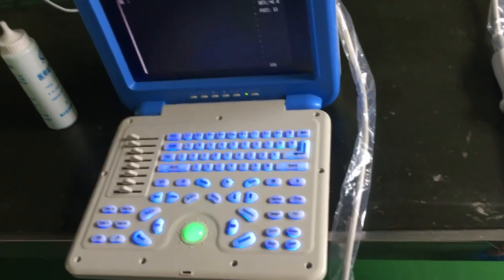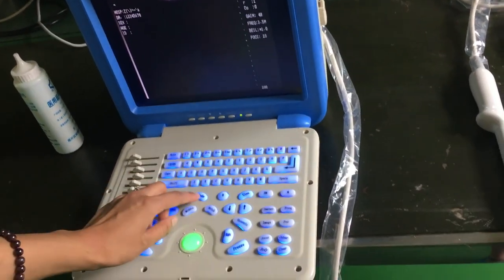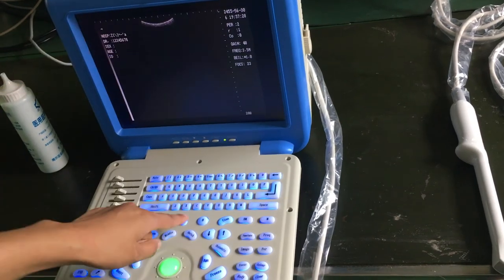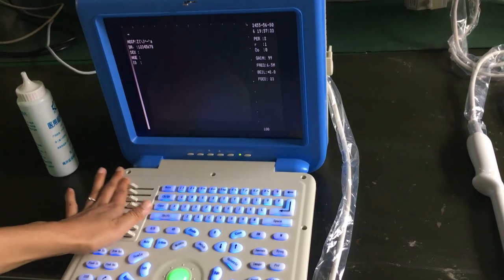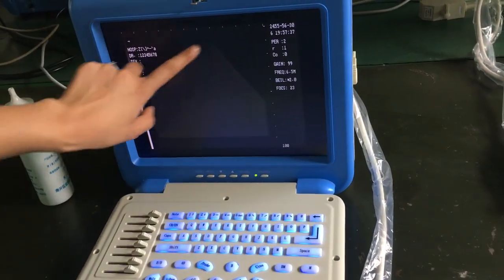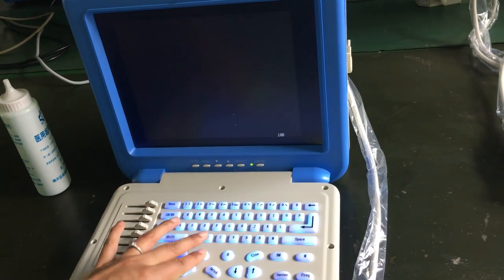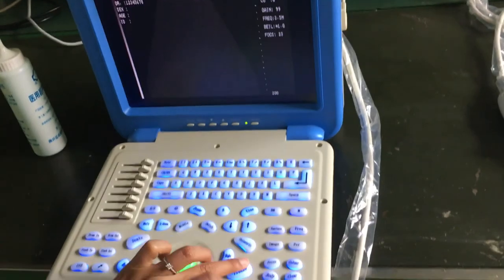If you want to use a different probe, you need to press the probe button and change to different probe modes. This mode is for convex use, this one is for transvaginal probe use, this is for linear probe use, and this is for convex and micro-convex probe use.